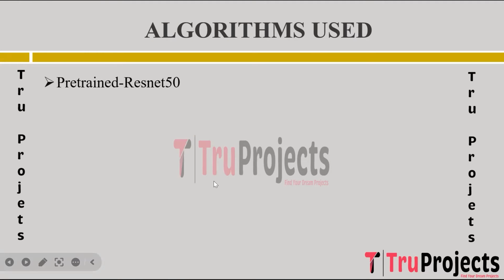Algorithms used to implement this project, we have utilized the following algorithms. The first one is pre-trained ResNet-50. ResNet-50 is a type of deep convolutional neural network, CNN, architecture that contains 50 layers. It's pre-trained on ImageNet, a large-scale image database, and has shown effectiveness in image classification tasks.